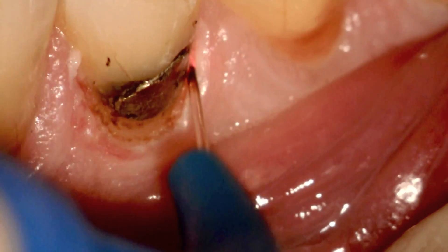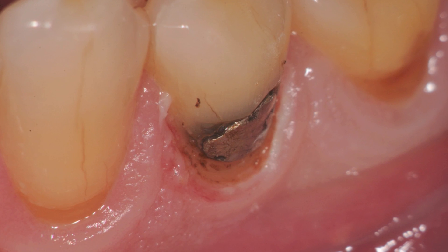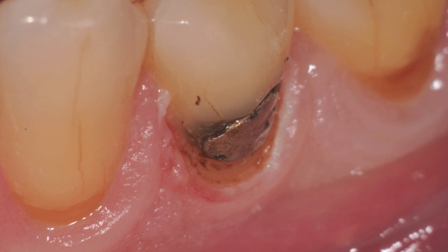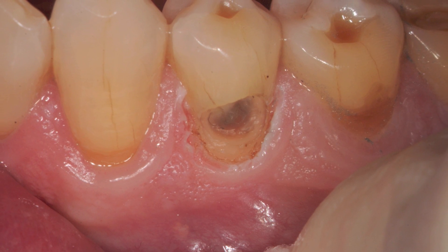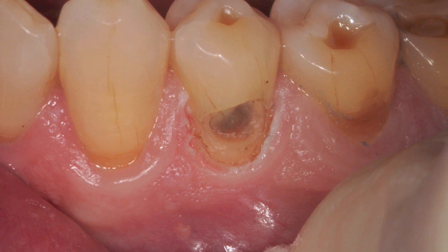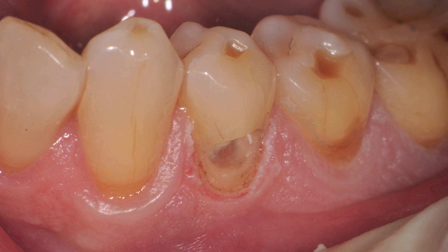So after roughly 40 to 50 seconds, you should have achieved enough retraction to be able to remove your amalgam safely without it cutting the tissue. And once the amalgam is removed, you can see the preparation is complete. Note the lack of charring that's occurred and how the tissue is at roughly the same level as a canine.